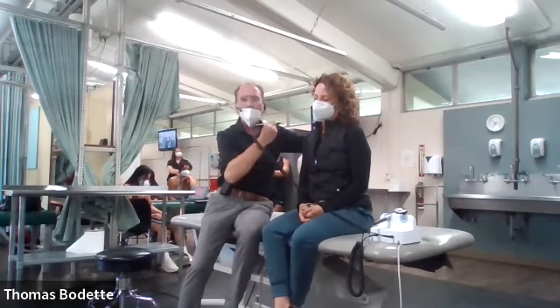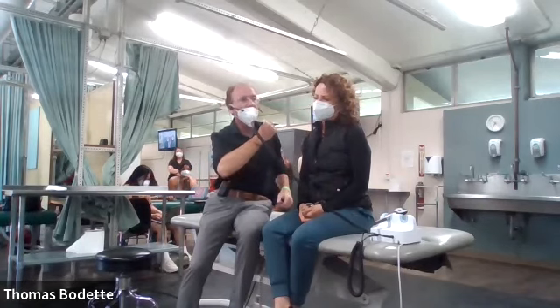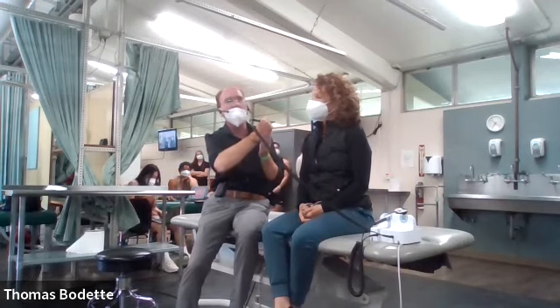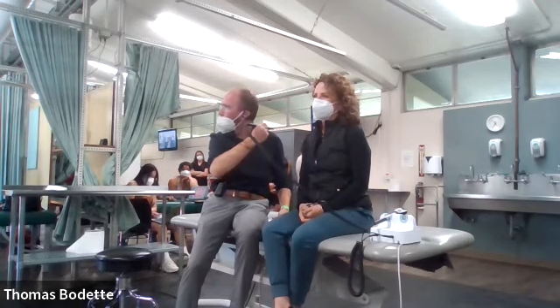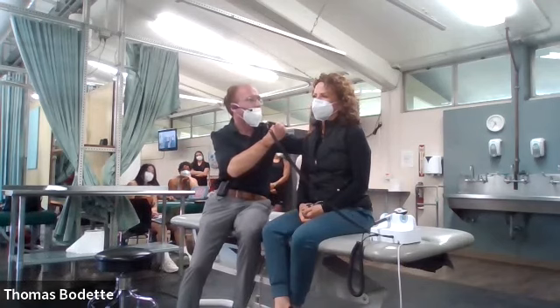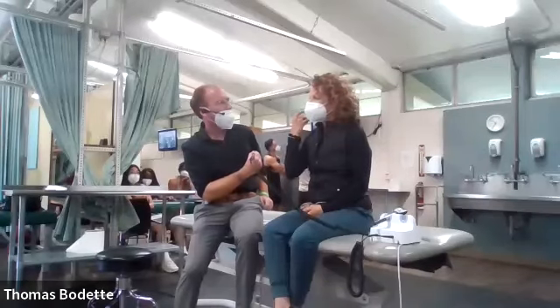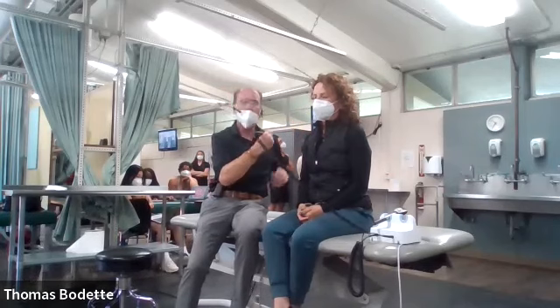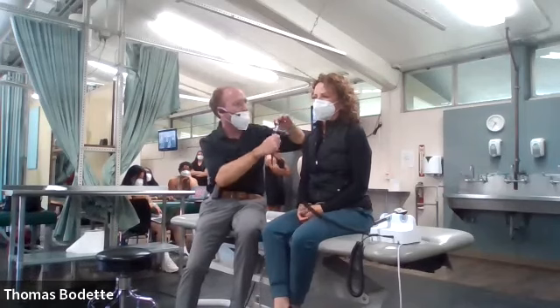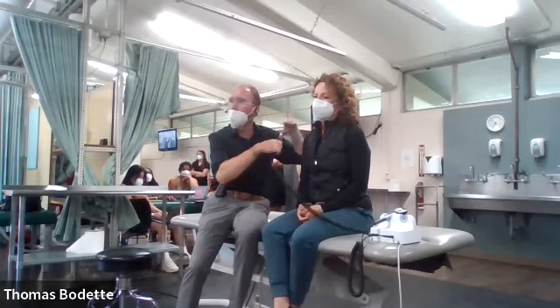I like to hold the otoscope sort of like a pencil, and that helps me use my hypothenar arm, and it's on her cheek, so I know not to insert the speculum too far. Make sense? All right, ready? So you can do that too. If you're not comfortable doing that, then there's nothing stopping you from holding it like so, but we are going to be looking for you to pull the pinna up and back. Make sense?